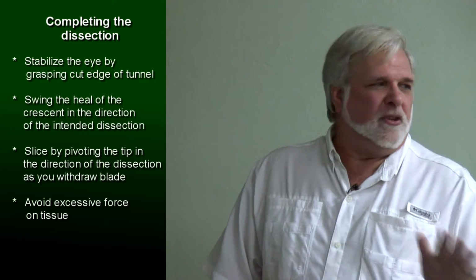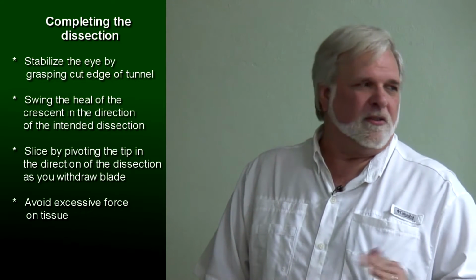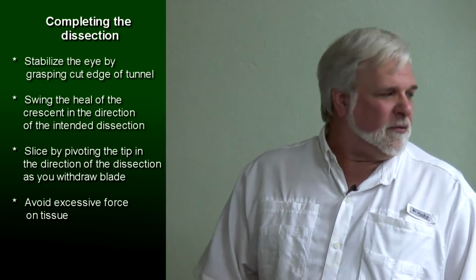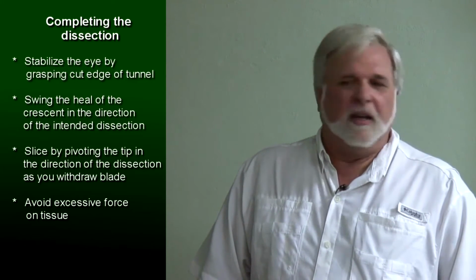Or that's the only point it should be extreme at all. And by extreme, I mean it's about 10 times more force that's being applied to the sclera at that point than at any other point during the operation. It's still not a lot of force, but it's considerably more at that point in the operation than any other point. You need good stabilization.